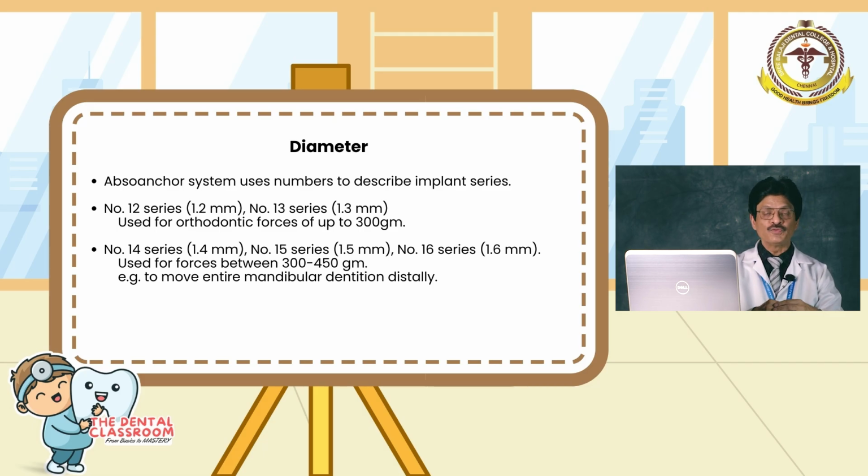Now when we say it is a 14 series, of course it is 1.4 millimeter. Then we also have the 1.5 millimeters as also the 1.6 millimeters. These are all used for forces between 300 and 450 grams. And these are used when you want to move the entire mandibular dentition distally or the maxillary dentition distally.